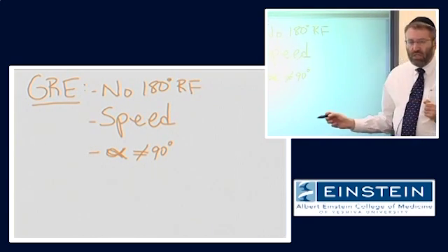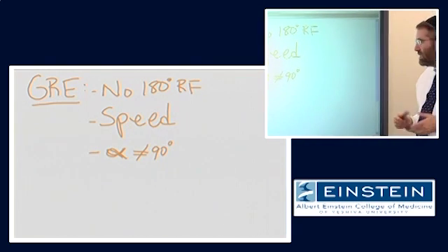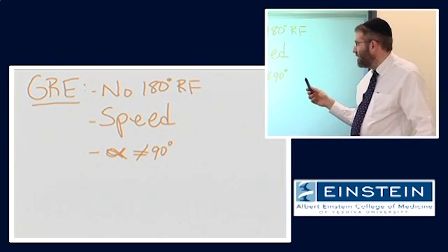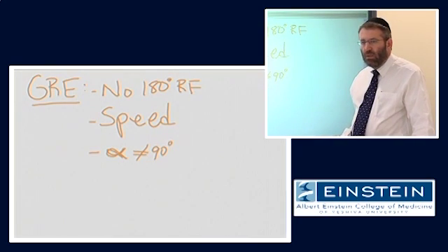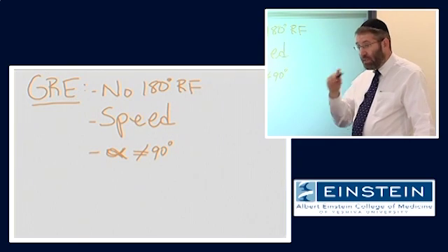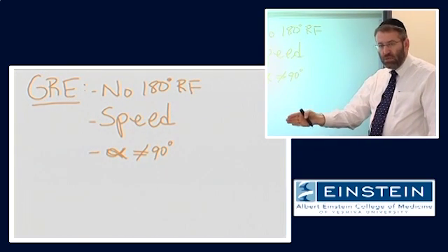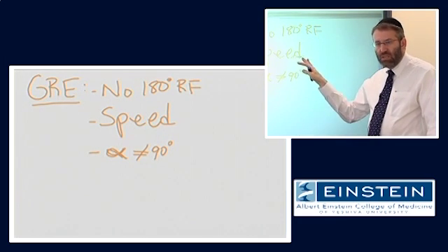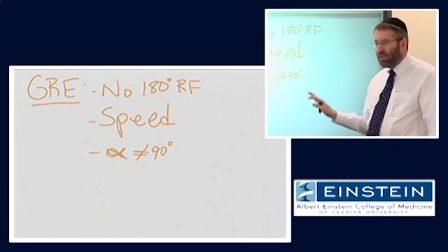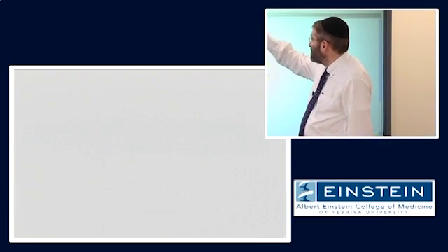There might be potential benefits to using a flip angle that is not equal to 90 degrees. This is definitely associated with gradient echo pulse sequences, but it's a misconception that it's a unique feature of gradient echo imaging. So I want to address this whole issue of how we choose the angle to which we flip the magnetization. We'll talk about it in the context of gradient echo pulse sequences, but keep in mind that it's not really unique to gradient echo at all.